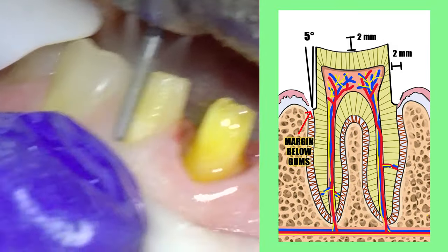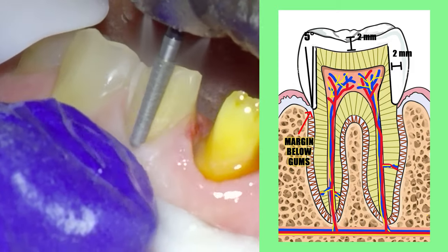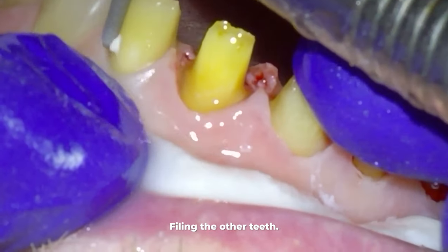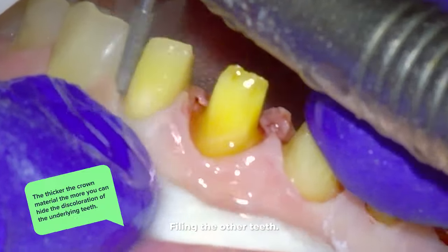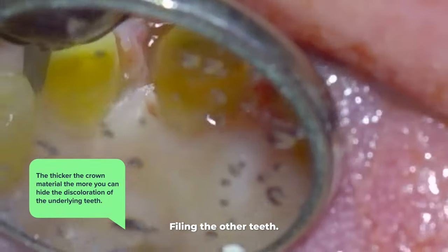We're creating a negative space that will eventually be filled in by those crowns. If you don't file them down enough, they're likely to break when chewing or during other normal activities at a minimized thickness. But another reason is the thicker the crown material, the more you can hide the discoloration of the underlying teeth.